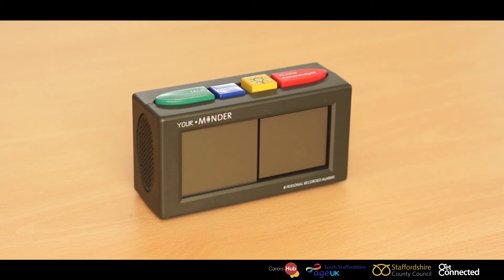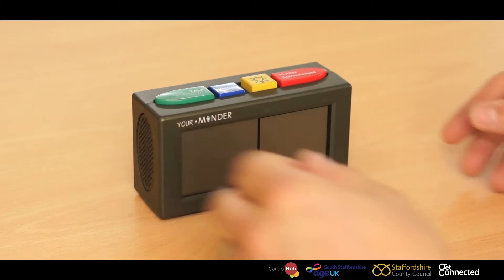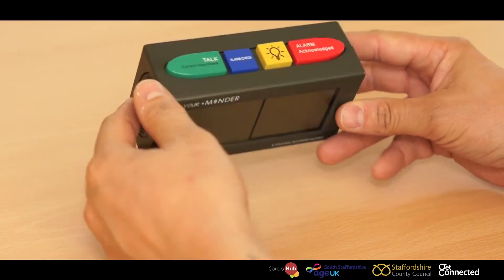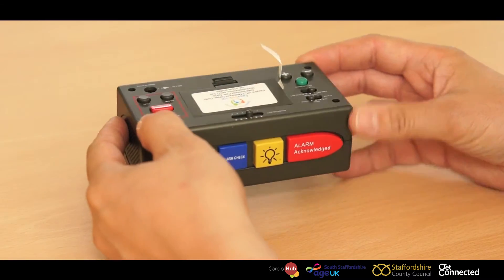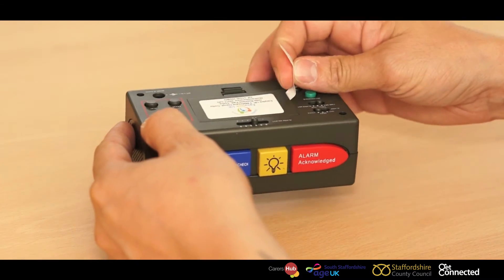Now we're going to set a your minder. First of all, pull the tab out of the batteries.